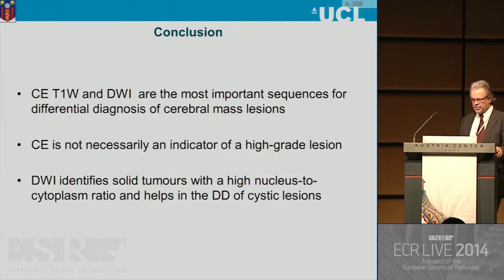So I hoped that in that brief and relatively quick tour, I managed to convince you, if you look at it and you don't want to use more sophisticated techniques like the next speaker will talk about, like perfusion imaging, just using contrast-enhanced and diffusion-weighted imaging, you can get very far in narrowing down the differential diagnosis and coming up with possible histologies and also coming up with alternative diagnosis.